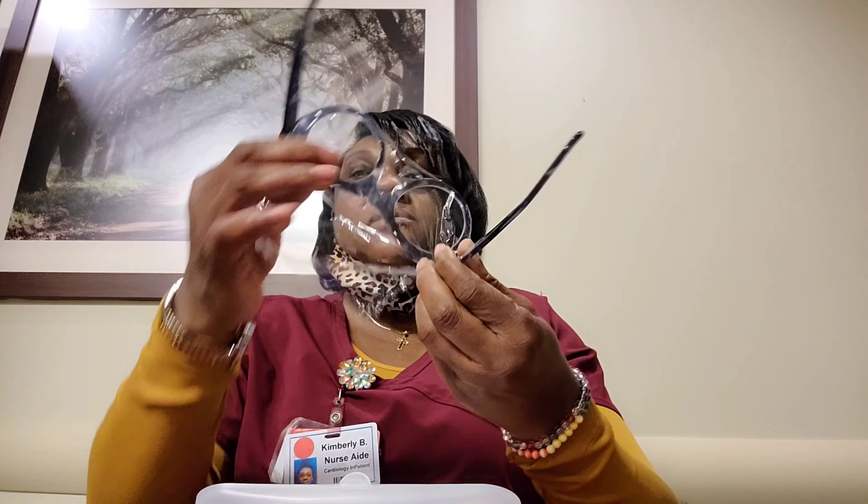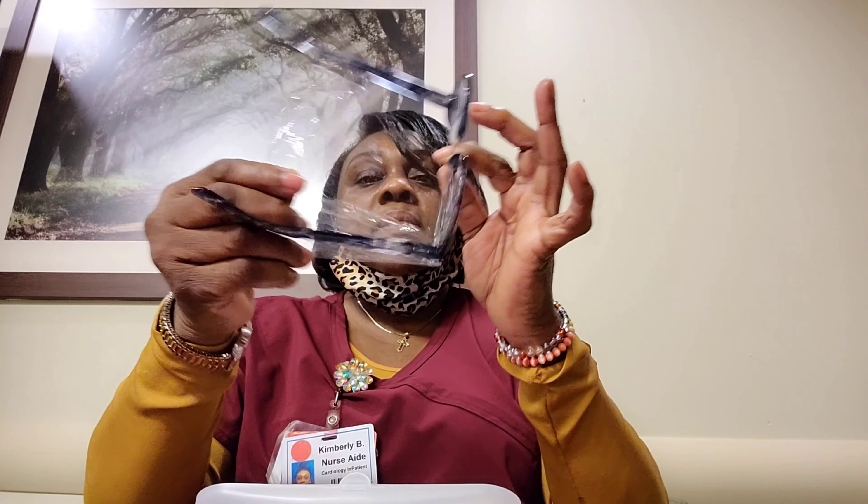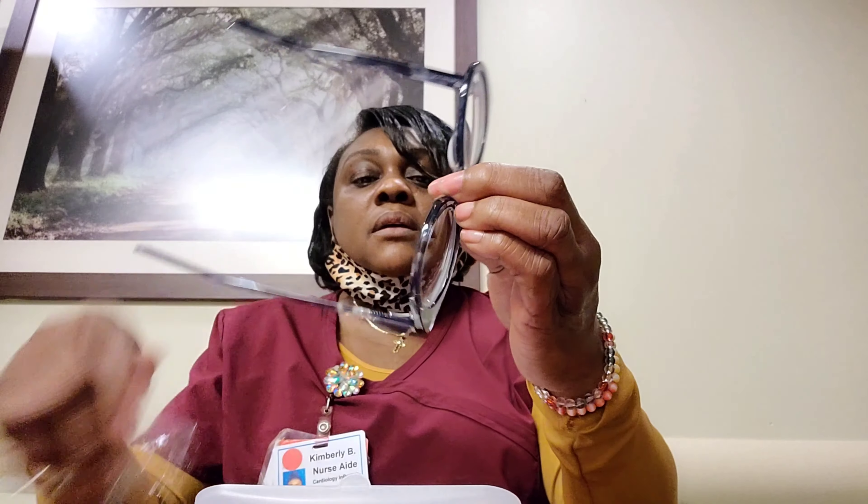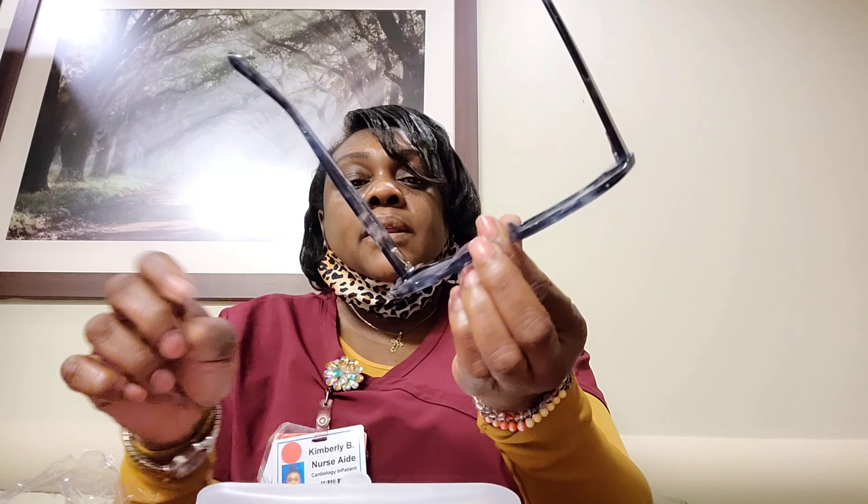So let's take them off. I got a little bit of stuff right here I wanted to get out. Okay, so these right here are what I got.